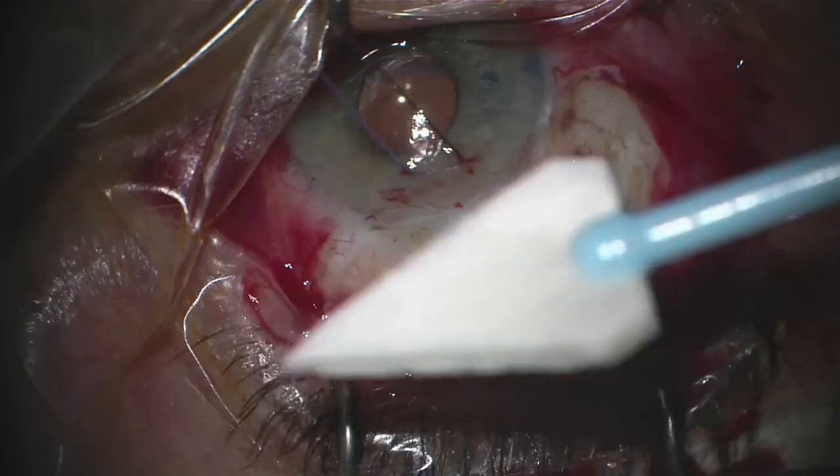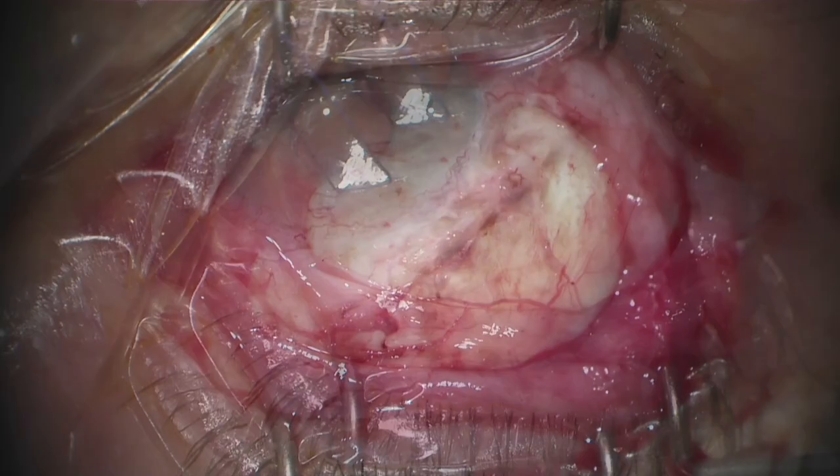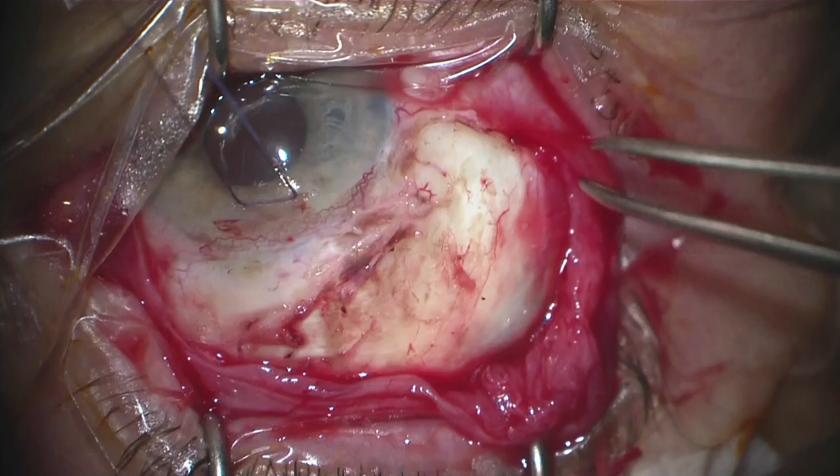This patient had a prior subconjunctival MIGS procedure and therefore there's a little more scarring. I do like to apply adequate cautery after I've freed up a lot of the scar tissue.